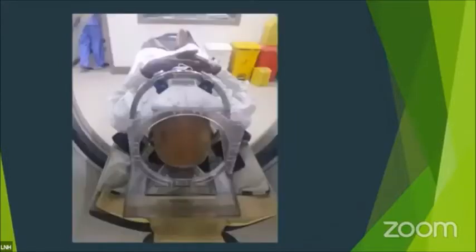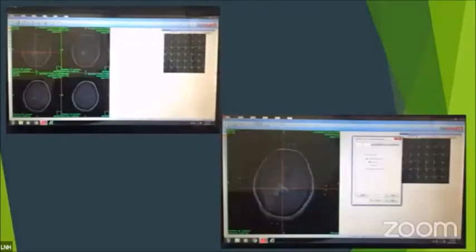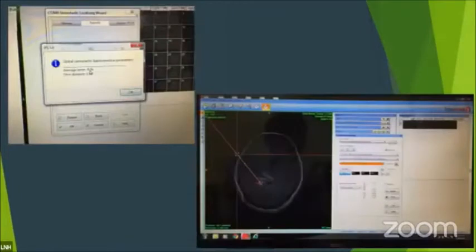So after choosing our patients, we place a head ring on the patient, which accompanies the frame, and the patient is placed for imaging. Since it's titanium, it can be CT or MRI. And this is the frame. After getting our images, we transfer them into the computer system, our IPS. It's very simple to use, and the software is very easy to handle. You just mark the lesion and your entry point for the biopsy.